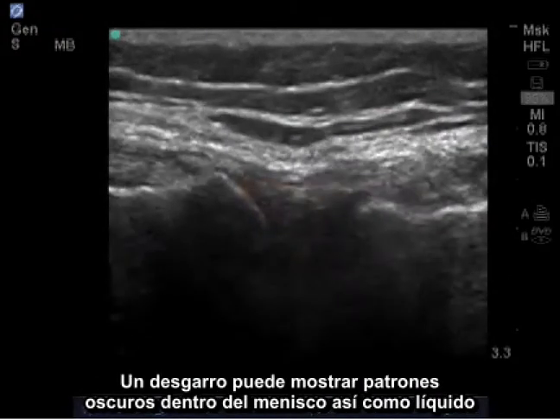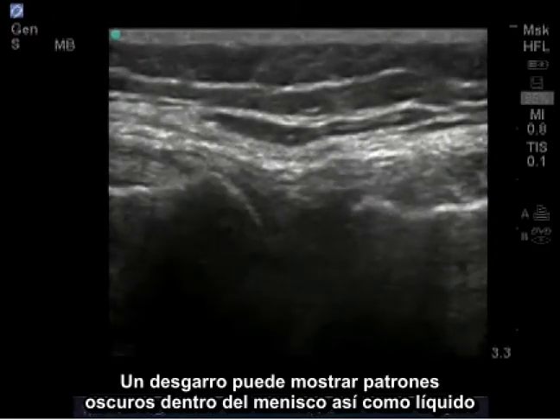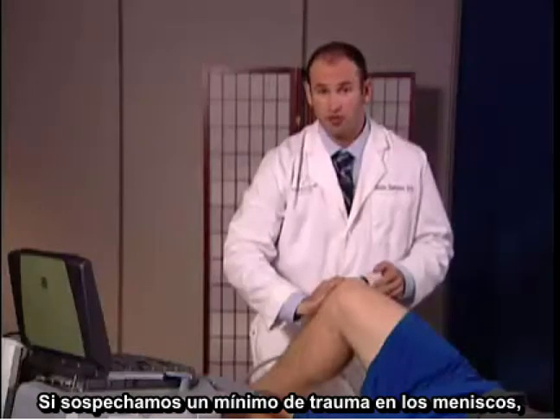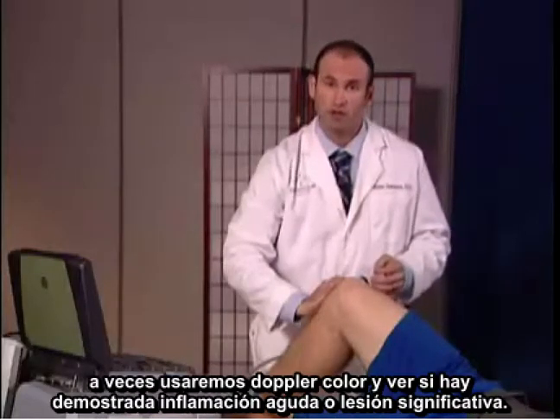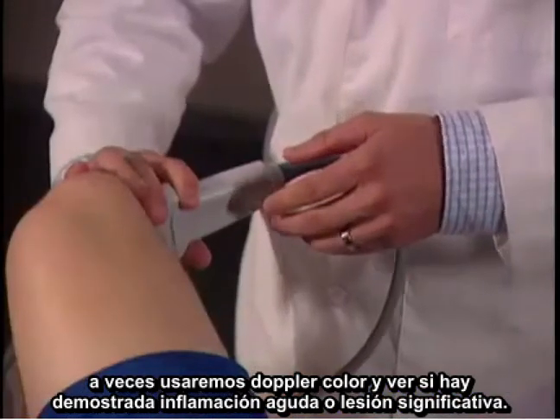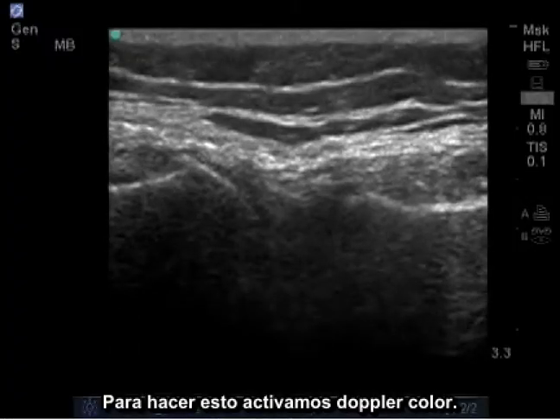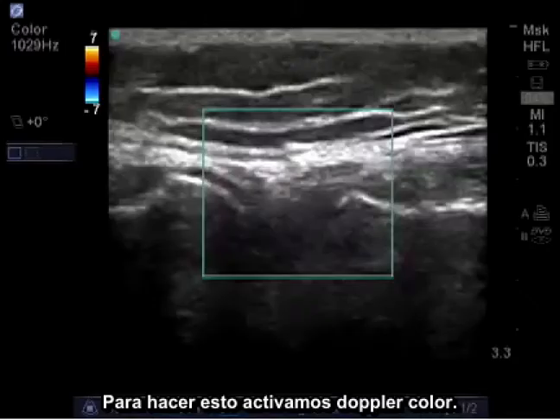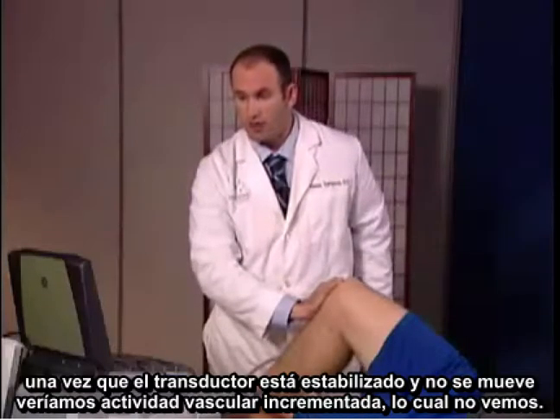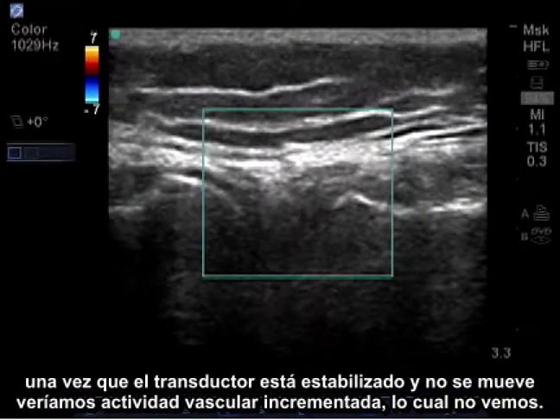A tear may show dark patterns within the meniscus as well as fluid leaking into the surrounding joint space. If we suspect meniscus trauma, sometimes we'll use color doppler and see if there's an acute inflammation or significant injury demonstrated. I activate color doppler, and if there was any acute trauma, once the probe is stabilized and not moving, we'd see increased vascular activity, which we do not.